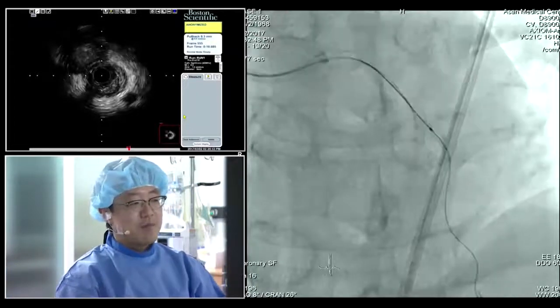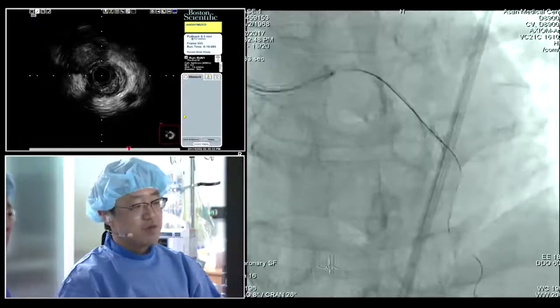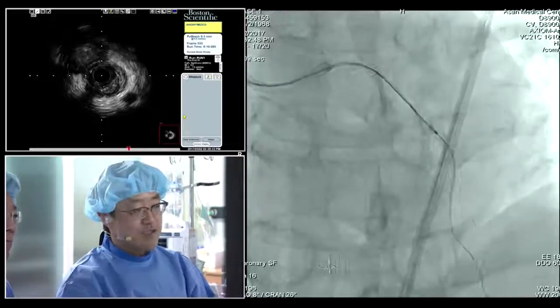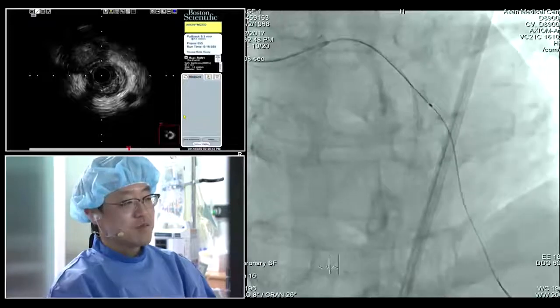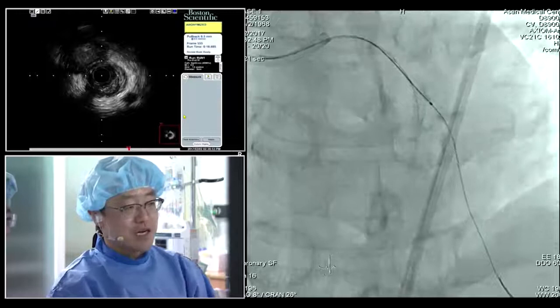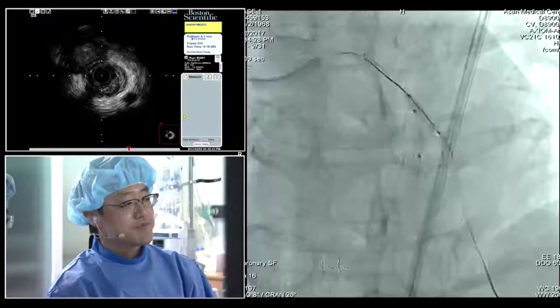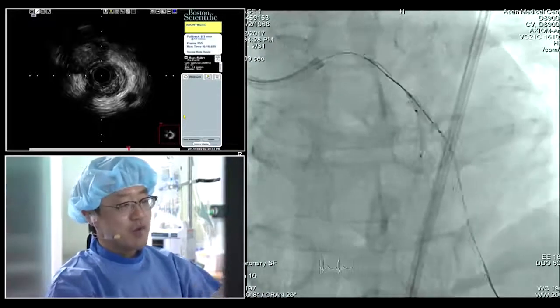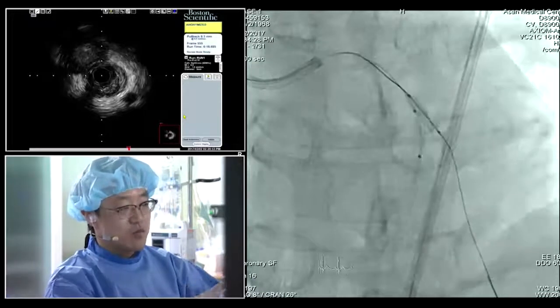So, okay. After POT, we crossed the wire to the diagonal ostium using the Choice PT hydrophilic wire, and the wire passed distally easily. And then we used a small size balloon, a 1.25 compliant balloon, to open the diagonal ostium, and next. And then next. And then we did the 2 non-compliant balloons at high pressure to make sure the bifurcation morphology was better.